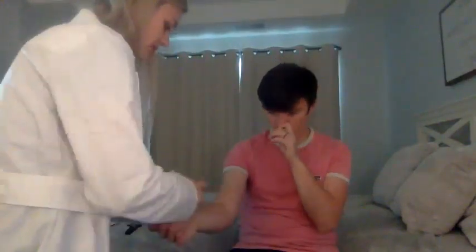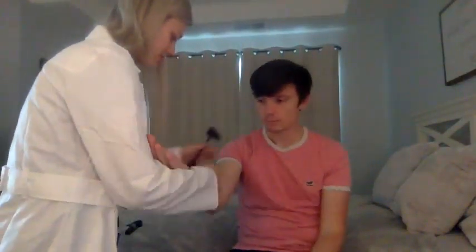Now I will be testing the deep tendon reflexes using my hammer. To do this, I will first test the bicep tendon. I will support his arm with my arm, and I will put my thumb on the medial aspect of the antecubital fossa, and I will strike my thumbnail with the pointy end of the hammer. Okay, and that was a good reflex there.